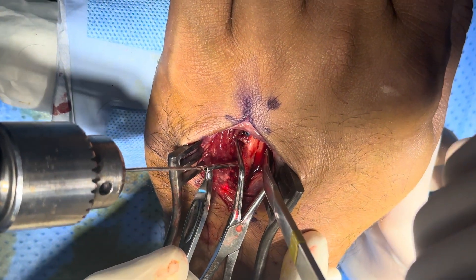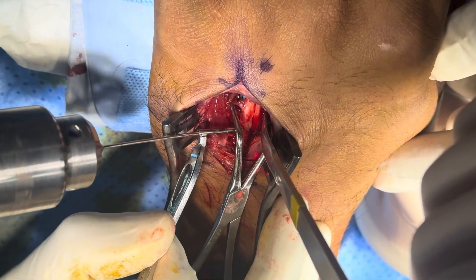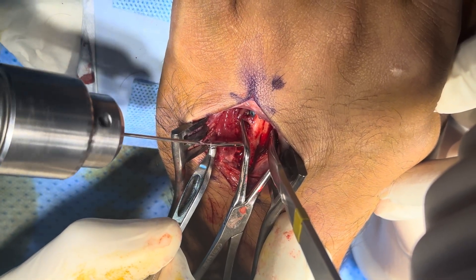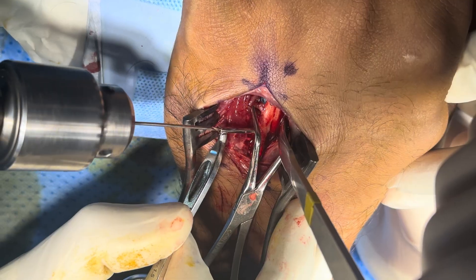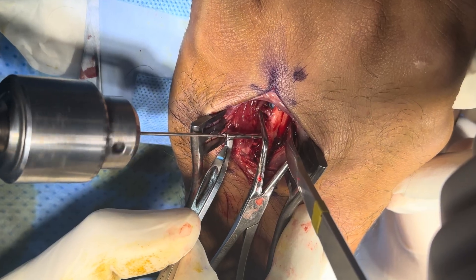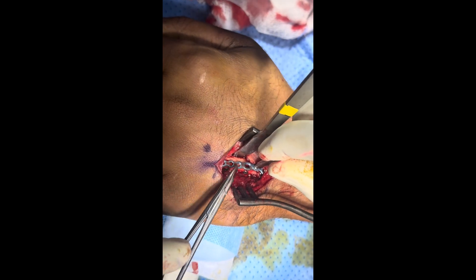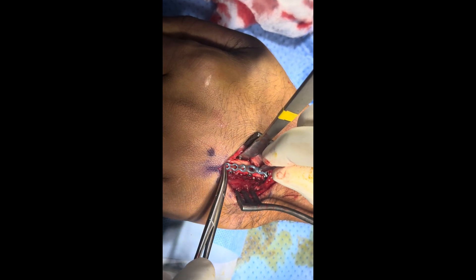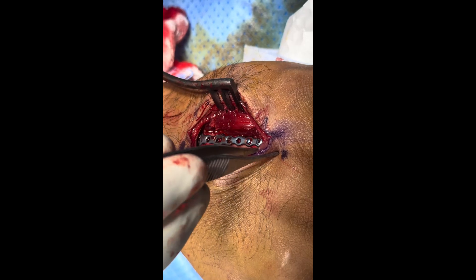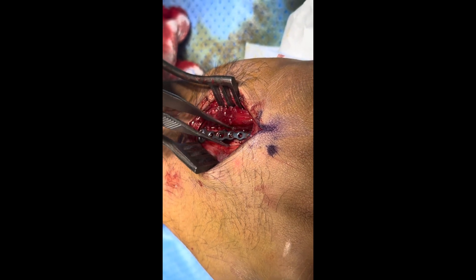I'm going to put the second lag screw in the proximal segment. We have placed the two lag screws and now we are going to put the neutralization plate. We will put two distal and two proximal screws, and then I'll come back to you. Two distal screws and two screws in the base. We will check the stability also.